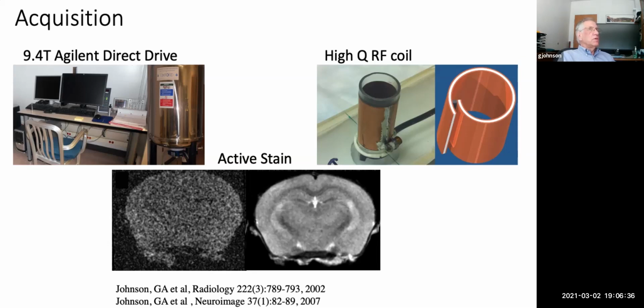We have built our own high Q RF coils. My graduate work was in electron spin resonance, and in electron spin resonance, we would build things called loop gap resonators that are really just solenoid coils. You see the strategy here is this is a loop of microwave substrate. So there's copper, Teflon, and copper, and it produces a parallel current path, which keeps the resistance very, very low. And now we do make most of these even without solder. So the idea is to get the highest Q resonator you possibly can.